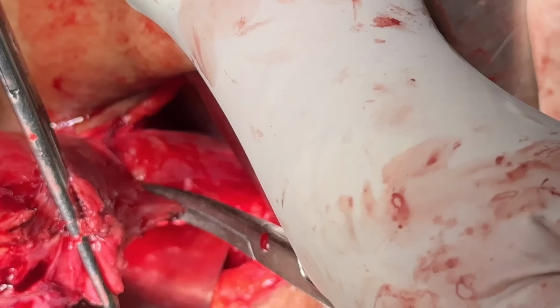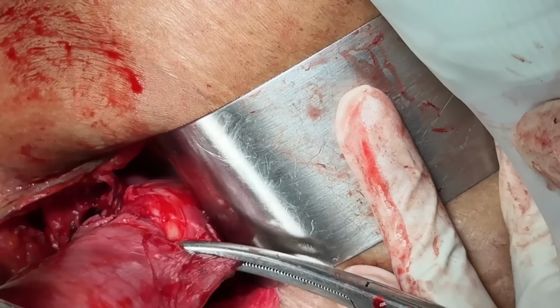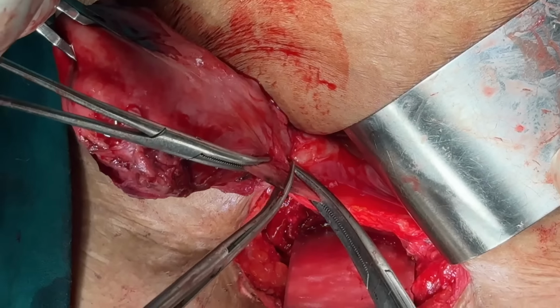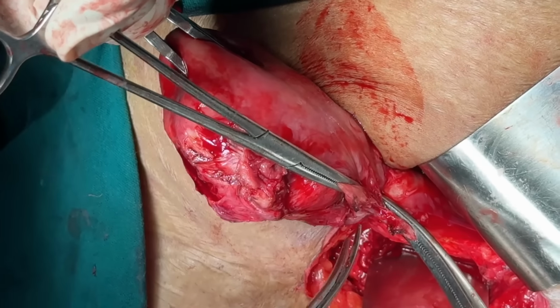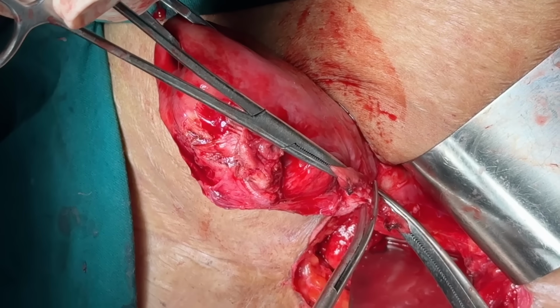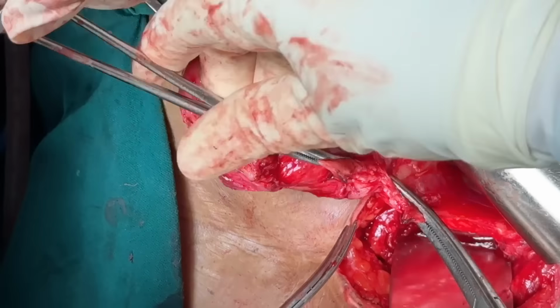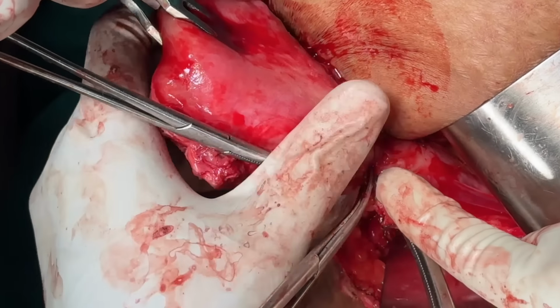Now move on to the other side. Clamp the uterine artery of the left side too, exactly at the level of internal os. For backflow, we have put another clamp, which is actually an artery forceps here. The uterus is small and the uterine artery is not that dilated. This is the advantage in this hysterectomy, which will not be there if the uterus is very much enlarged in size. So keep that in mind.